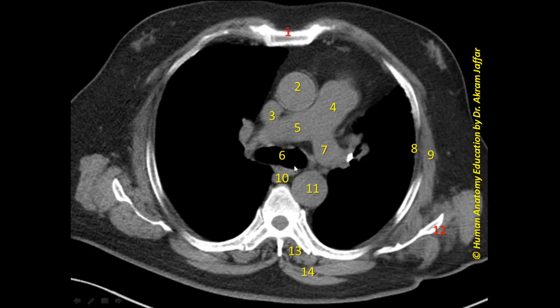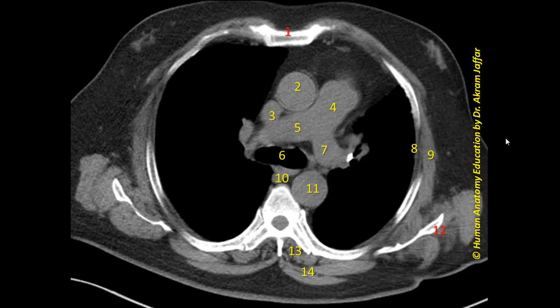Identifying the bifurcation of the trachea, bifurcation of the pulmonary trunk, and the presence of both an ascending and a descending aorta at the same section — all these support that the level of the section is at the transthoracic plane, at the level of the lower border of T4 vertebra and at the level of the sternal angle anteriorly.